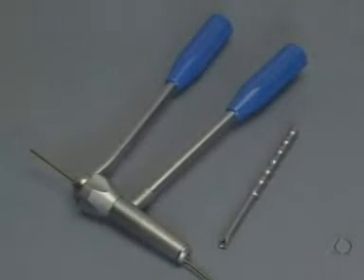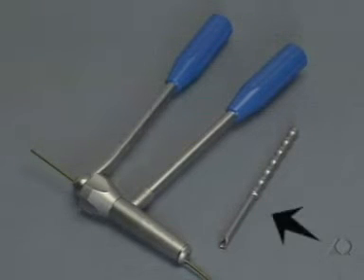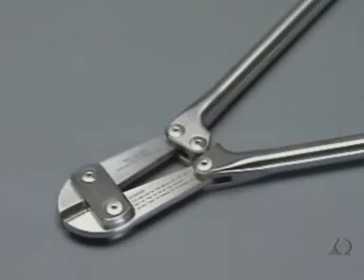To shorten the nail, the cutting instrument is provided. Care must be taken to ensure that the correct opening is used, which corresponds to the proposed nail diameter. The beveled impactor is provided for the definitive placement of the nail. When the special cutting instrument is not available, the standard bolt cutter can be used.